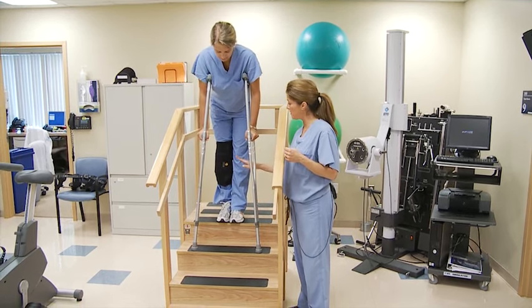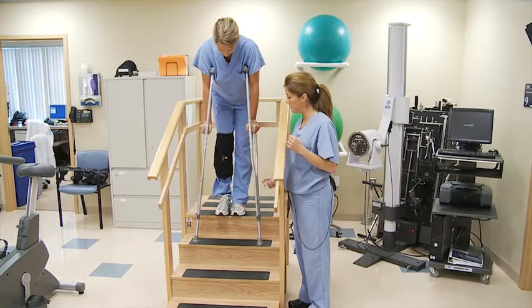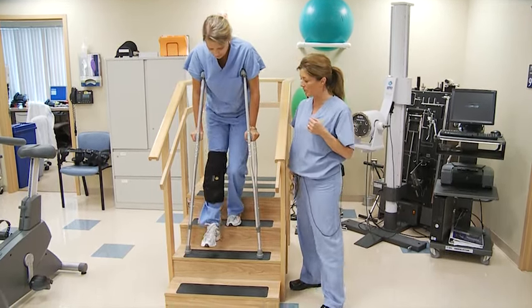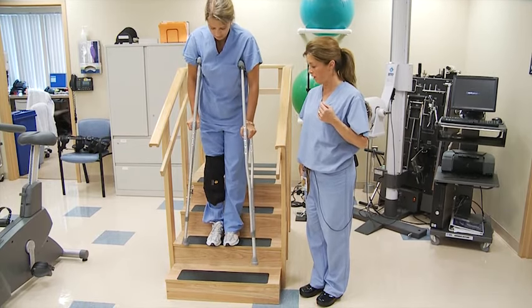And then this sequence is: down with the operative, then meet with the non-operative. Down with the operative, meet with the non-operative. Down with the operative, meet with the non-operative.